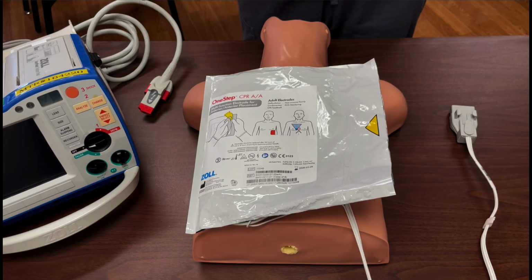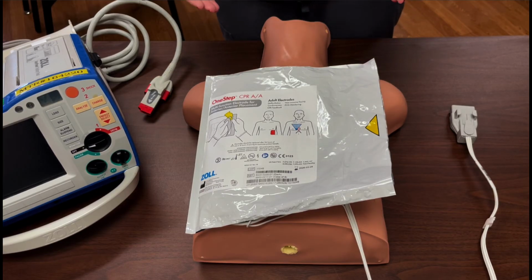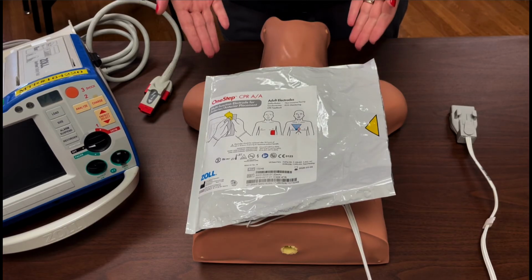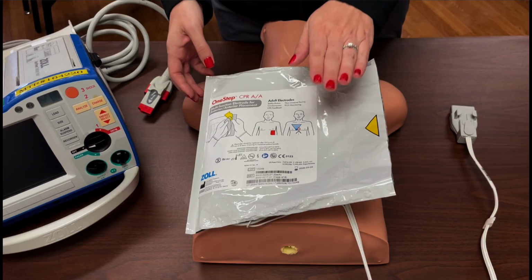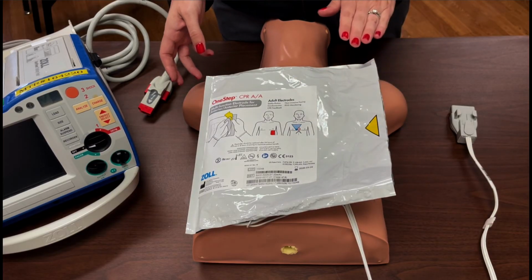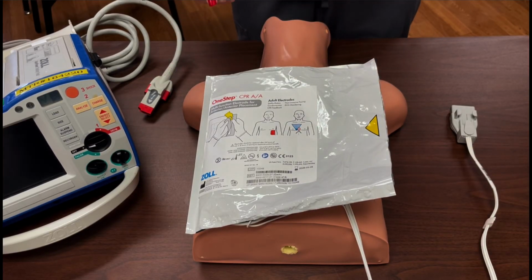as Lucas recommends that the plunger should be in direct contact with the patient's chest. If you have a patient in the emergency room who experiences a sudden cardiac arrest and you're placing the pads yourself, then you can place the puck again to the side or on the patient's chest if you're going to be using a Lucas device.